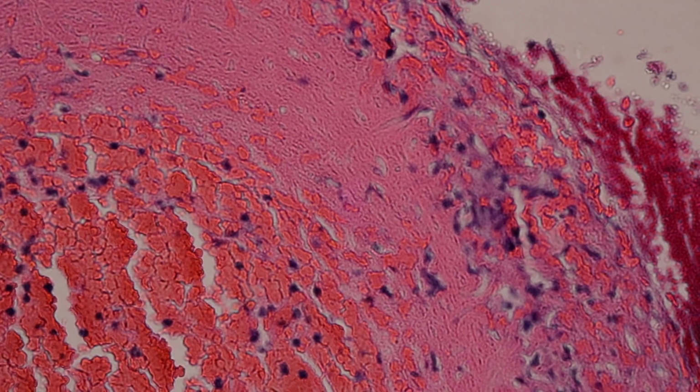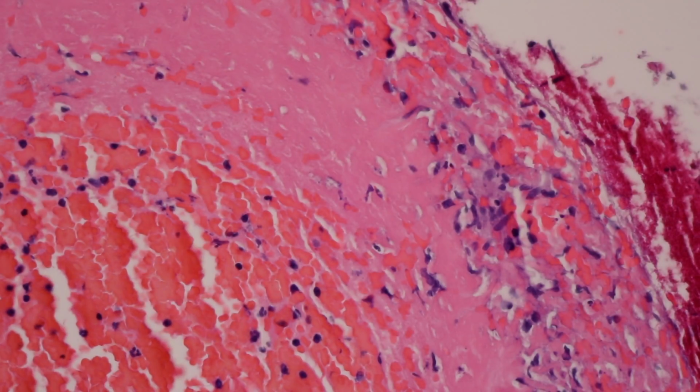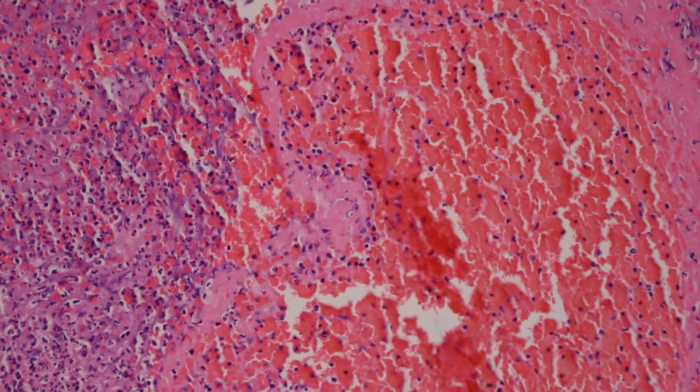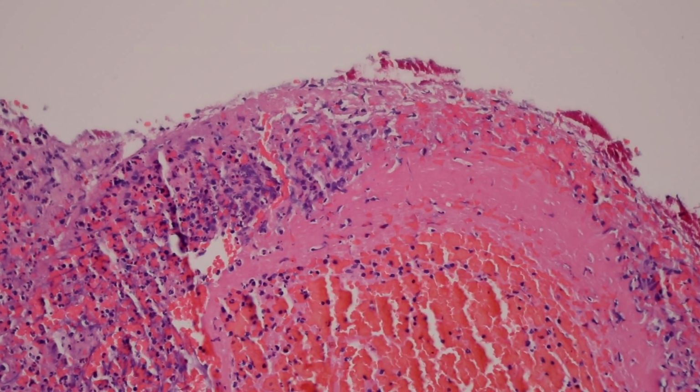And also when you go to higher power, and if you flip the condenser too, you can see it better, I think. You can see that the blood's still made of individual red cells. So if you're having trouble telling blood from fibrin in vessels, which I think is hard at first when you start doing dermatopathology, you can flip your condenser and look closely to see if you can see individual red cells filling up the space. That's probably just blood, and if you see more of this pink smudgy stuff, it's probably fibrin.